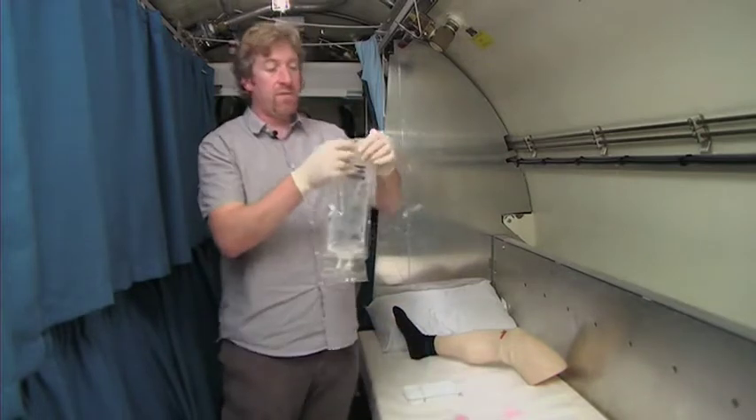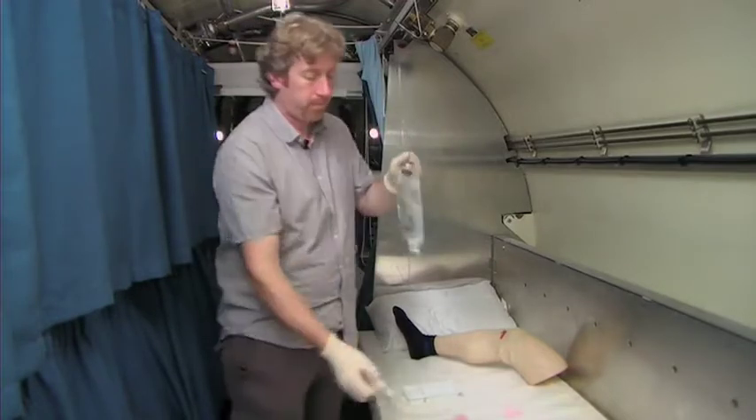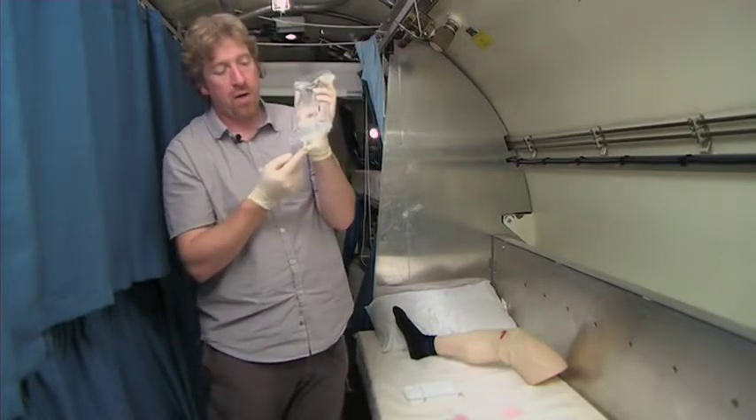So we start off with the bag — it's in a sterile package. You just open the package like so. There we have our bag. Down below we have two ports.